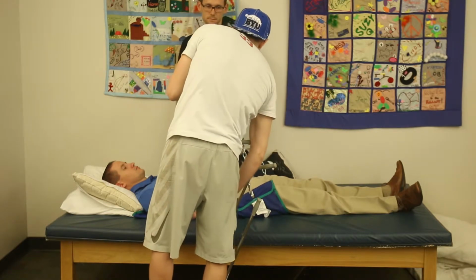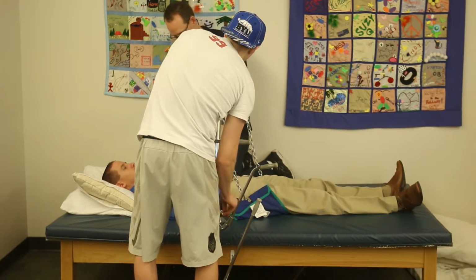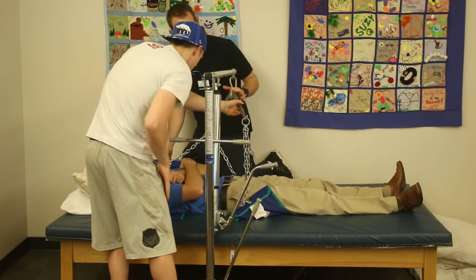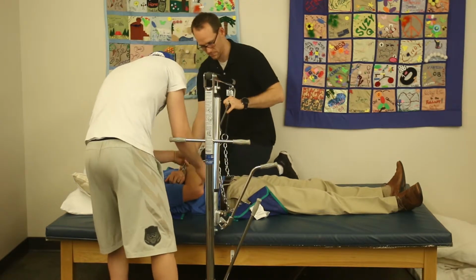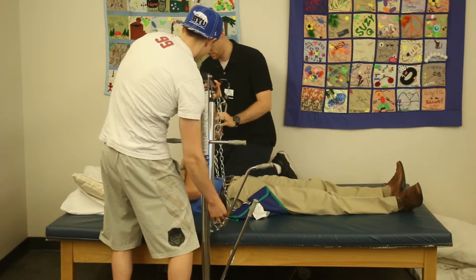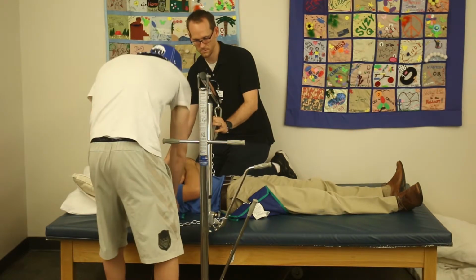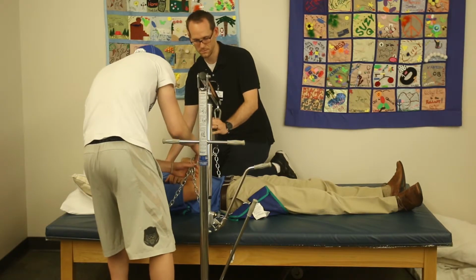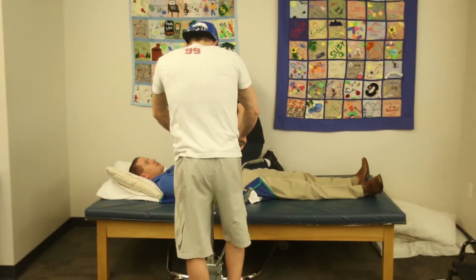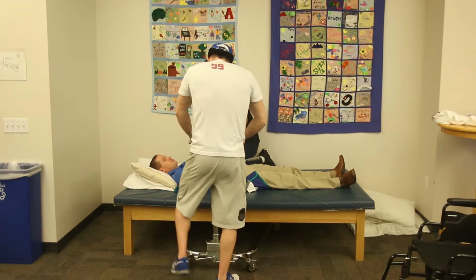And we'll have to lower this a little bit so that we have some more slack. Make sure that I hold it so it doesn't just drop. Okay, just a little bit more. Okay, looks like it's falling off there, so we just want to make sure it's still connected. Okay, you feel stable right now? Great. All right, we're going to pump you up. I'm going to lock it into place while we do that part of it.